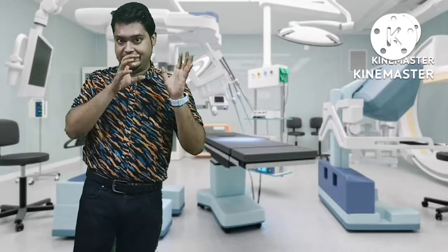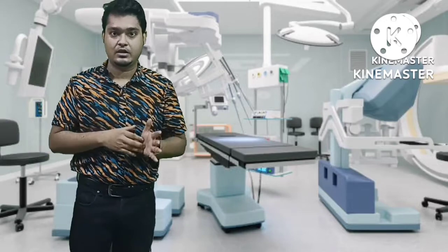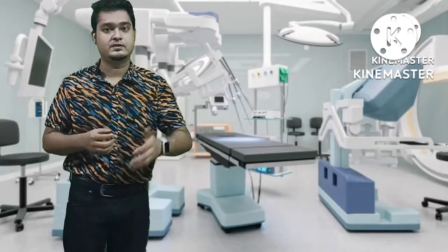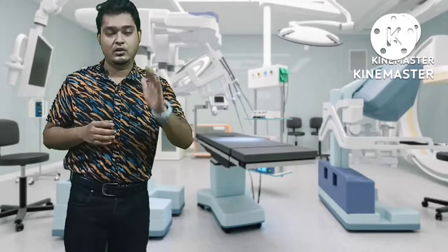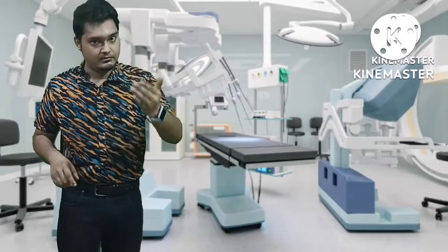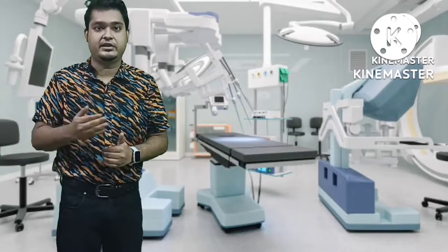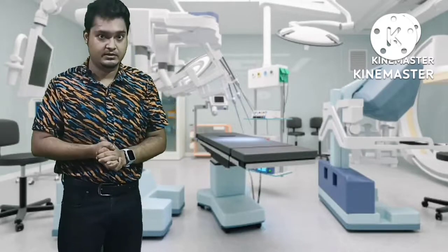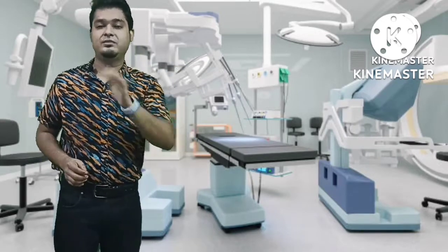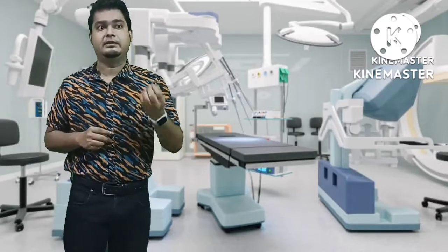Okay, so in catheter coronary angiography we are using a C-arm machine, and the machine uses X-ray radiation, and also in CT scan we are using X-ray radiation. The difference is that in CT scan the amount of radiation is a little bit higher, so there is a chance of radiation-induced effects in the patient who is undergoing CT coronary angiography. But in catheter angiography the radiation is not that much higher as compared to the CT scan, so it is a little bit safer.